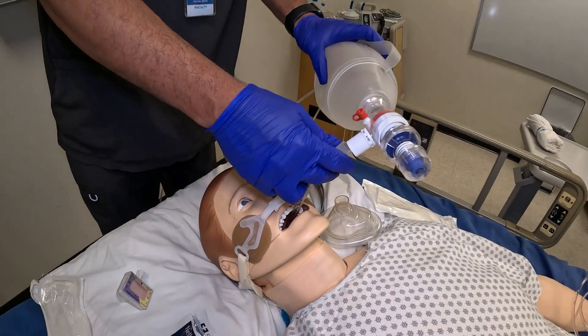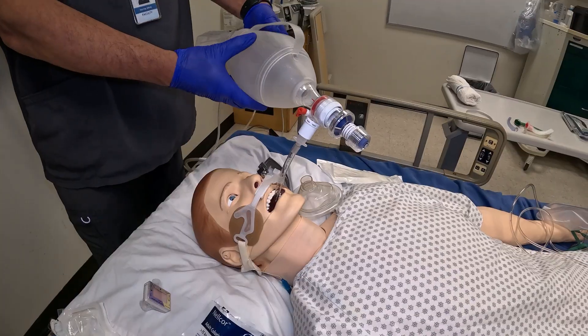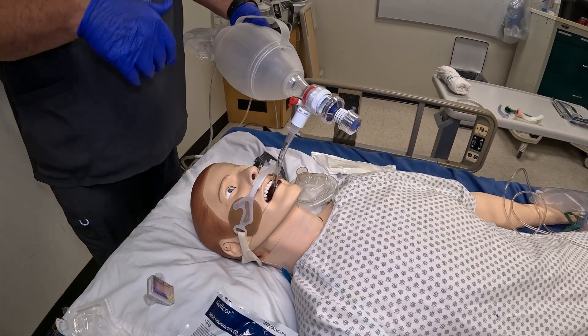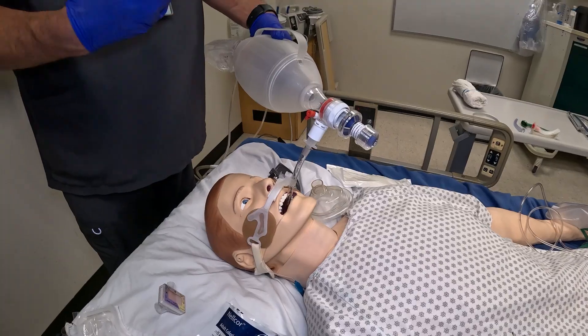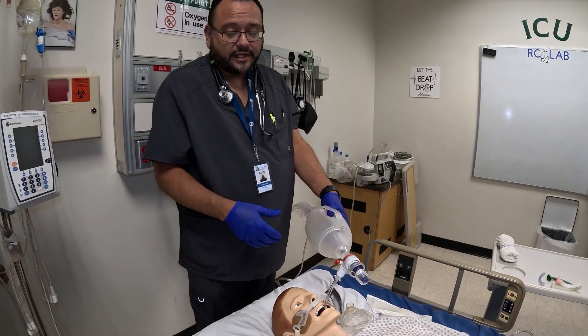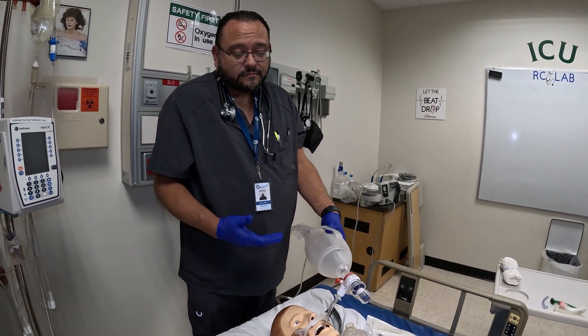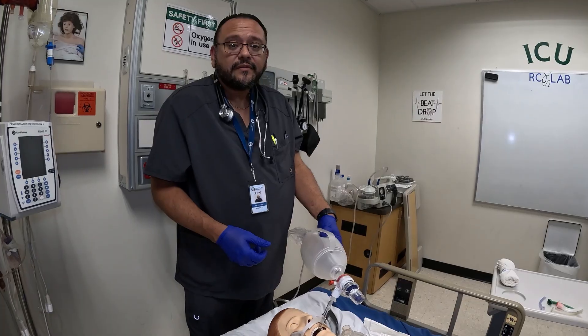As we've done this, we're going to make sure the patient is getting good volumes and adequate breaths. We're going to make sure all the vitals are good, order a chest X-ray, clean up our mess, and make sure we document. And that's all we have — thank you very much.